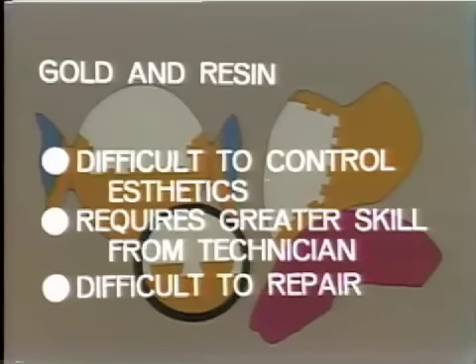Should these pontics wear or fracture or break out in any way, they are difficult to repair and often require the removal of the bridge to effect a satisfactory repair.